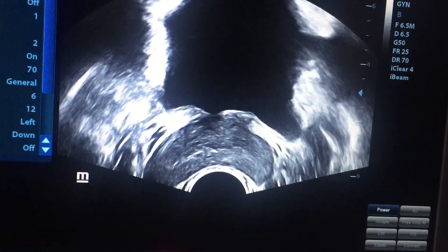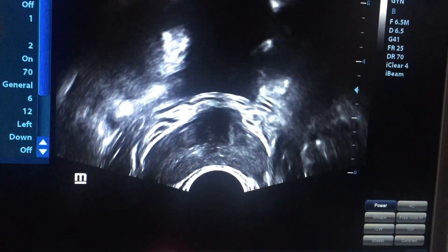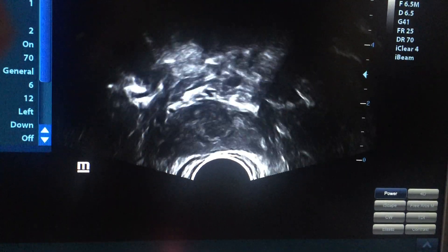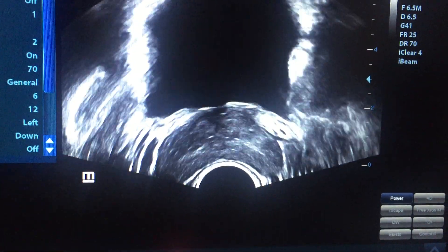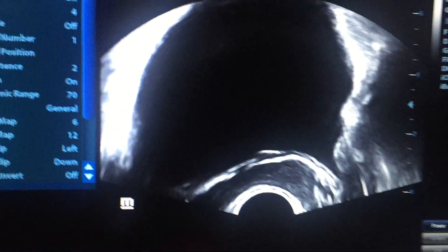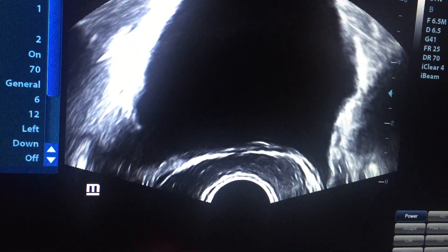This is the transverse study of the prostate. We are now at the apex of the prostate — this is the apex. Now we are going to the base of the prostate.